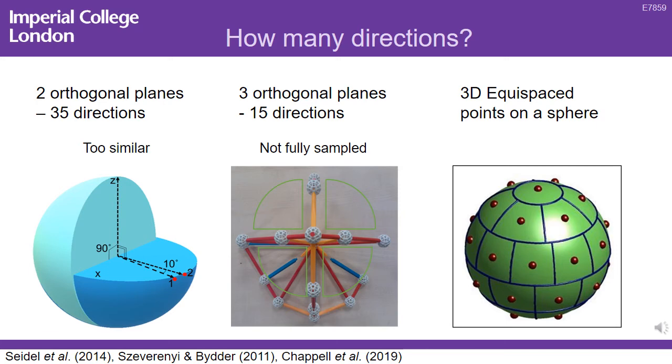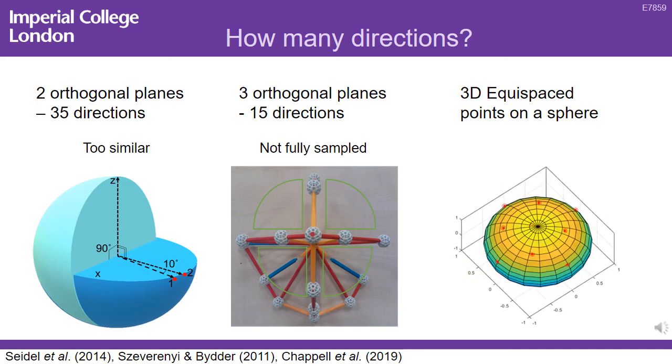We postulated that the minimum angle between B0 must be maximized so that the scanning orientations needed to be equispaced in 3D. Mathematically, that actually turned into quite a difficult problem to solve. We used the Leopardi solution, which partitions a sphere into regions with equal areas, before running simulations with 15, 9, 7, and 5 scan directions.